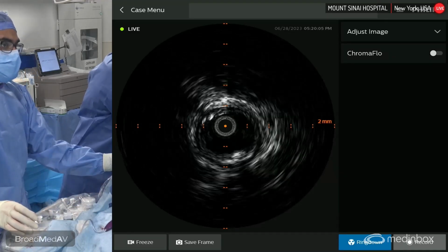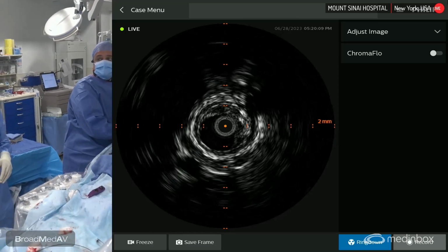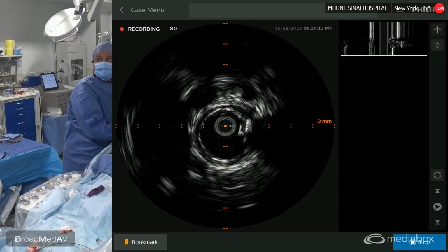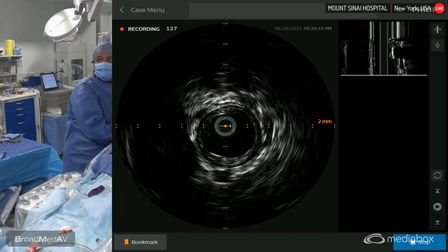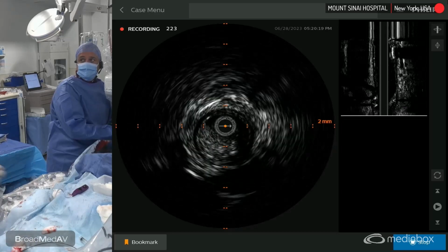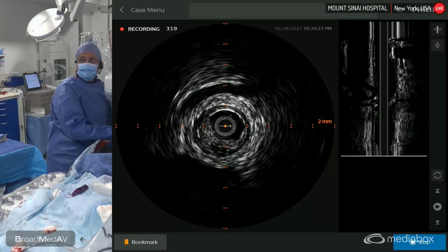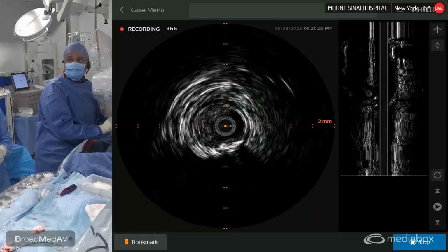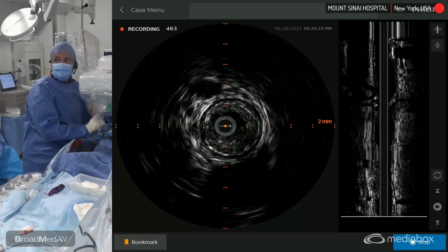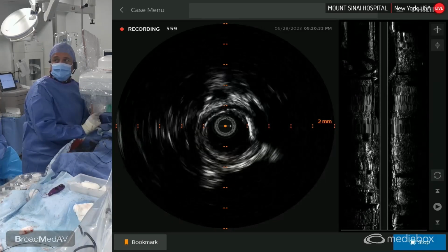So again, starting distal to proximal. On, please. So record. So I'm just pulling back here the IVUS, and you can see here, very good resolution, good lumens, about a 5 to 6 millimeter lumen. And again, that's the occluded segment, a little bit of dissection there. But you can see that the lumen has gotten much bigger with our atherectomy device. Clearly, probably can do more cuts here. But clearly, I think with the two lumen cut, we've done a pretty good job.